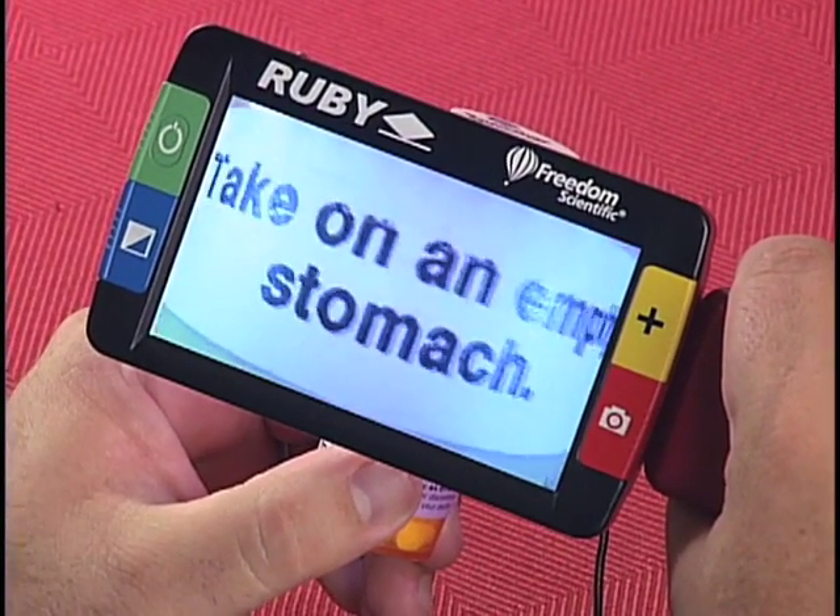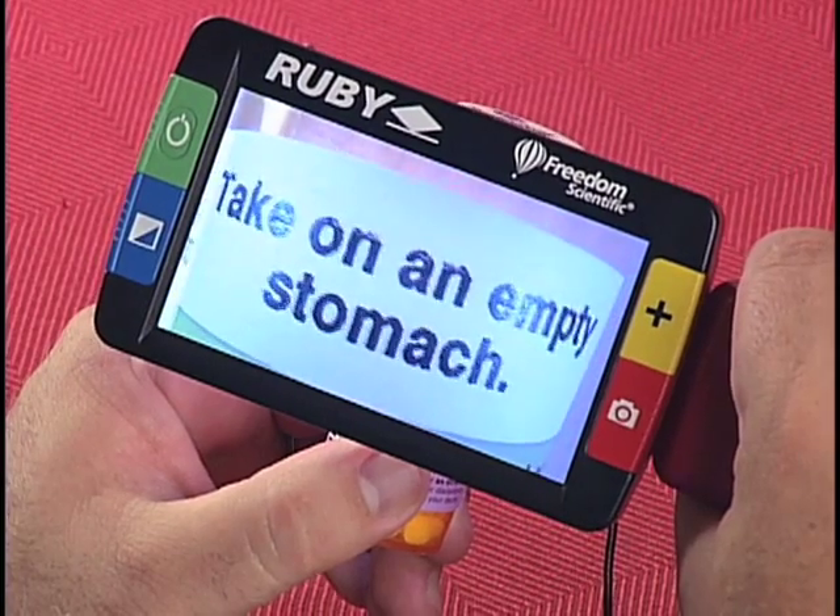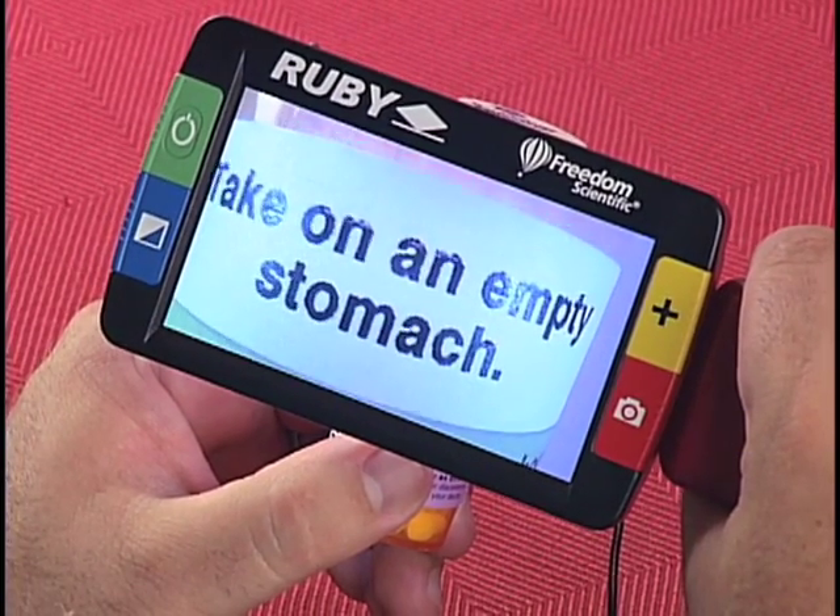By just flipping out the handle, I can hold it up to read product labels, appliance controls, almost anything I come across.